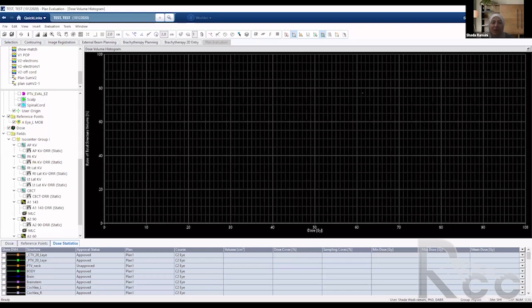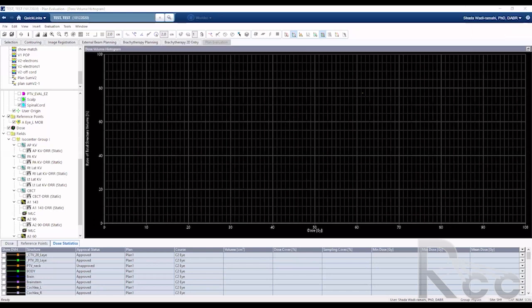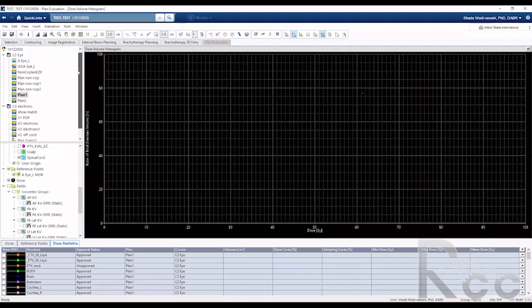So I am sharing screen right now. What I have here, I have created two plans. Can you see my clinical screen? Yes. Okay. So two plans, plan 1 and plan 2, and that is the same one that we saw for the brain, with a large PTV sitting right next to the left eye. I'm going to call them plan 1 and plan 2. And the prescription, if I remember correctly, is 40 gray. We'll see it now. All right, hold on, I'm scrolling through to find what I want.